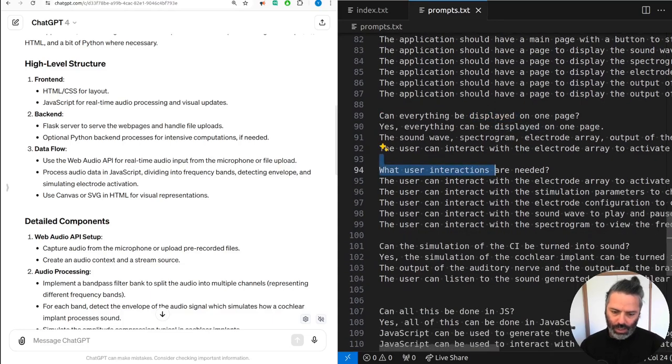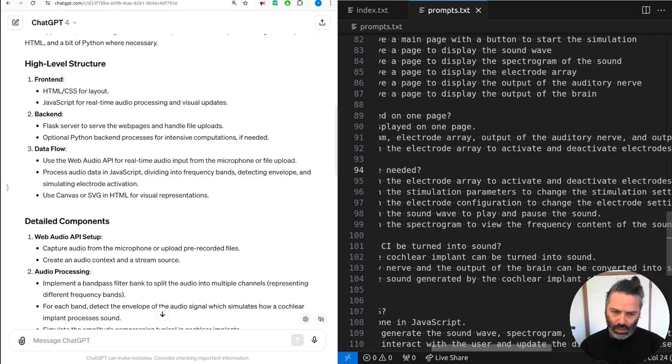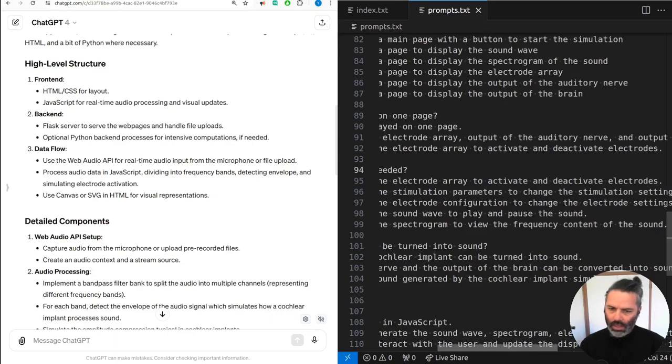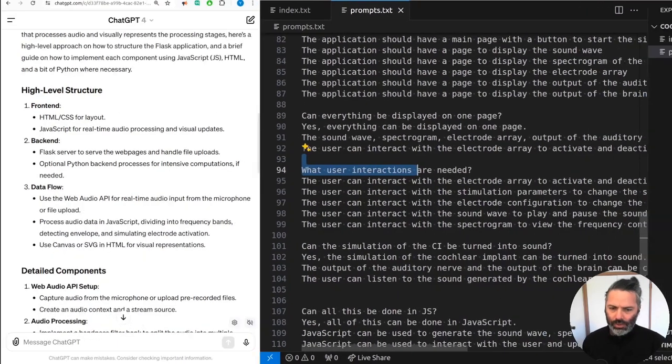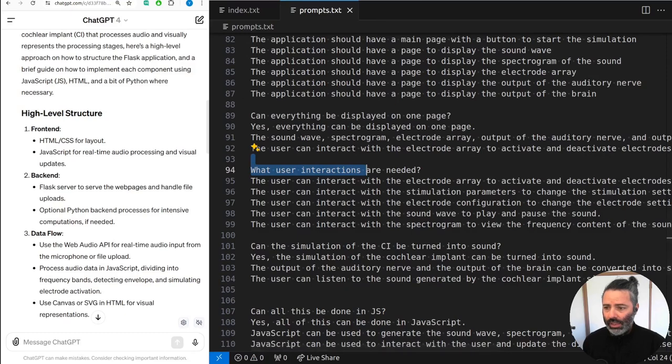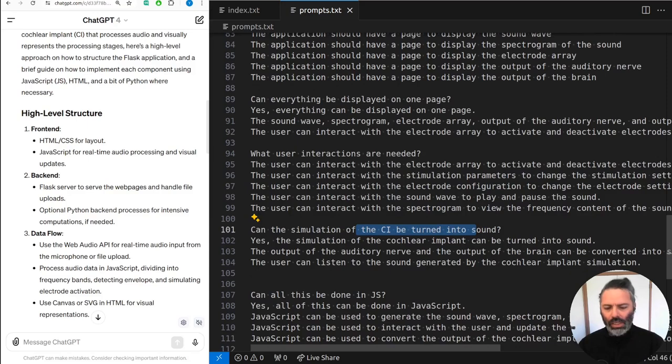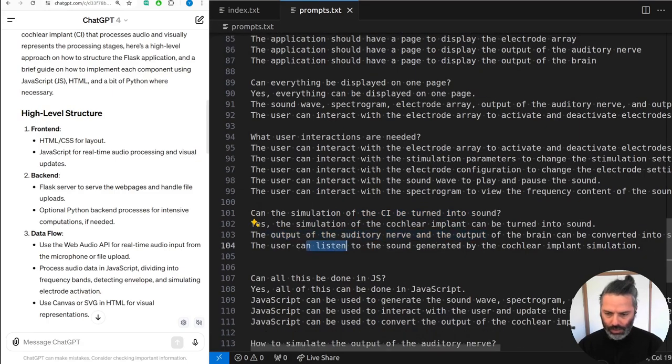User interaction needed. Yeah, so I guess primarily the interaction will be with the sound, the input sound. Play, pause, I'm not sure about that. Ideally, just interact using a microphone, and the simulation be turned into, right, and the output of the simulation we want to turn it back into sound as well, so you can essentially hear what a patient with a cochlear implant might be hearing.